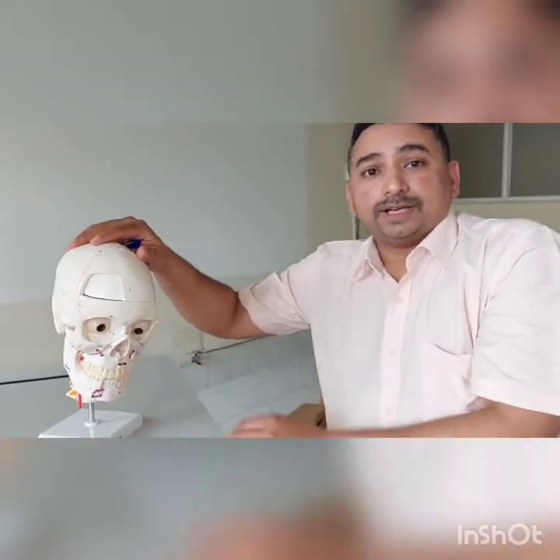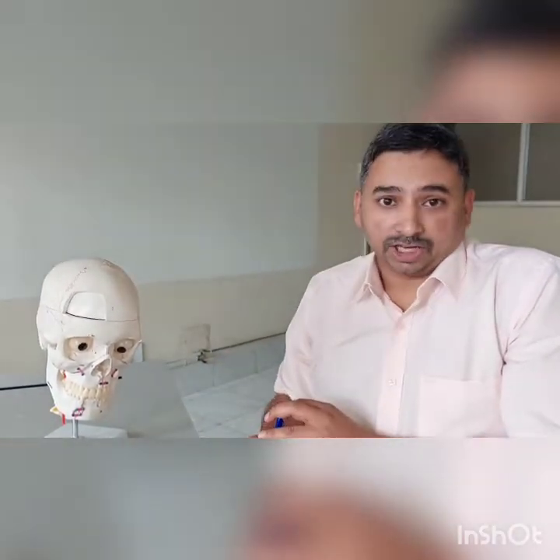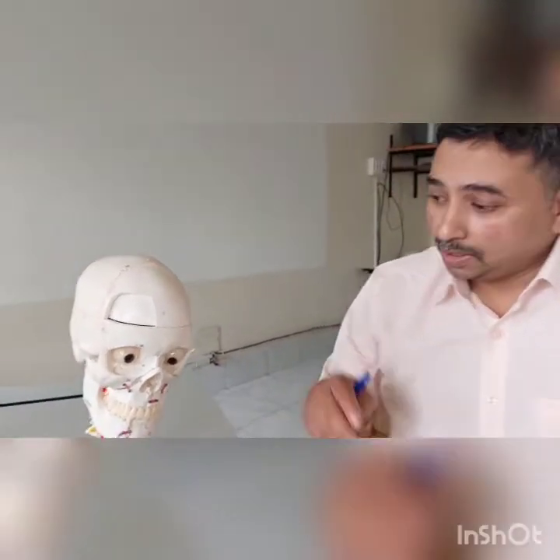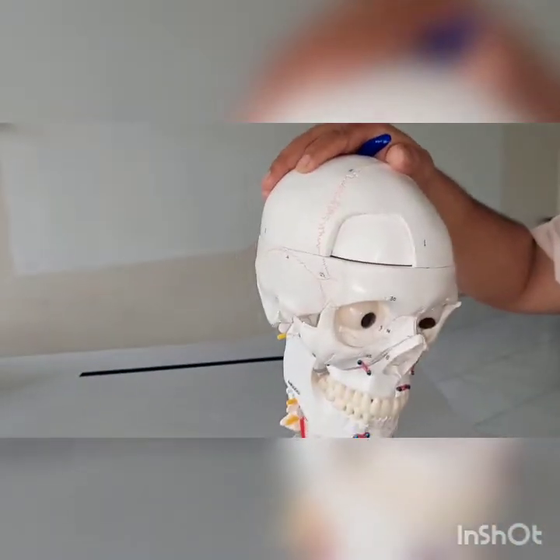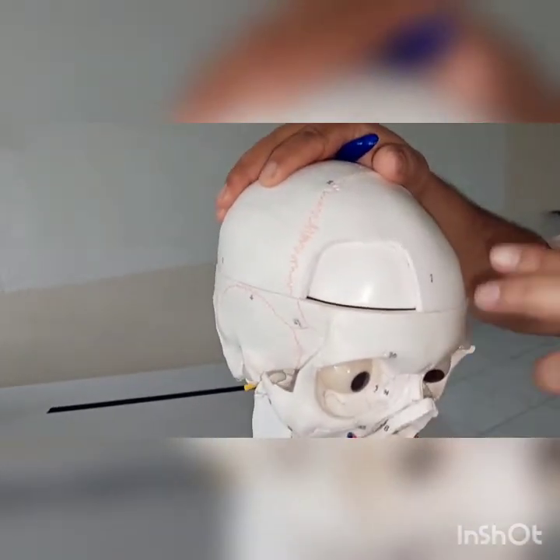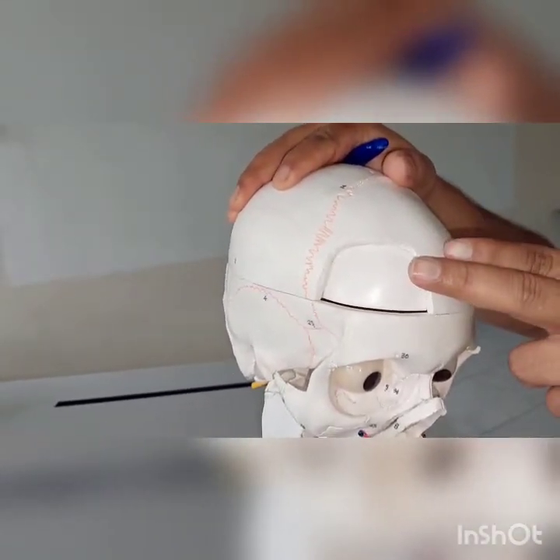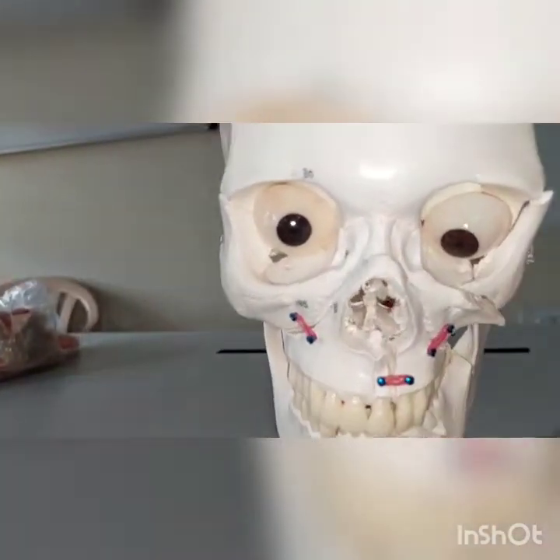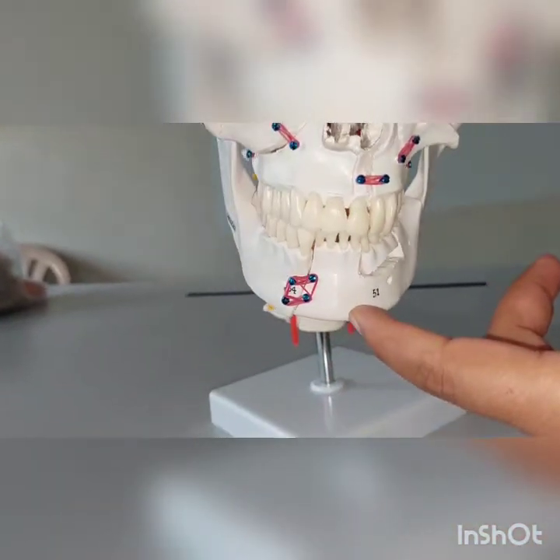This model has been created with an emergency medicine clinical person in mind, and the day-to-day clinical fractures he will be encountering in the casualty, so that he can have a basic clinical examination done and give the right reference to the right person at the right time. This model from the top to bottom depicts the cranial frontal bone depression fractures, the zygomatico-orbital bone fractures, the maxillary Lefort fractures and the mandibular fractures.